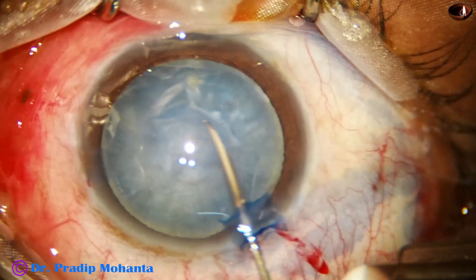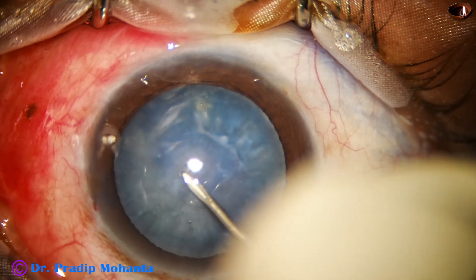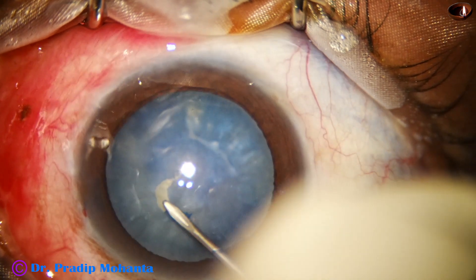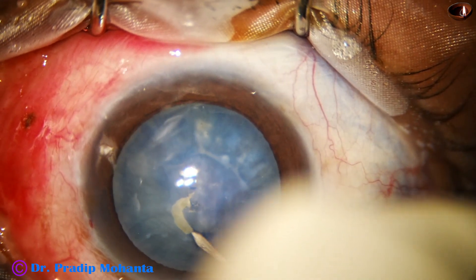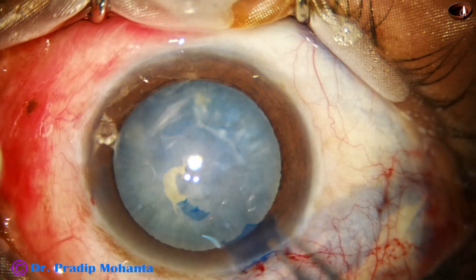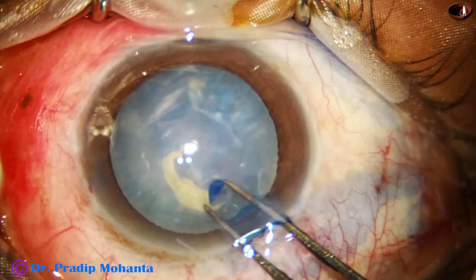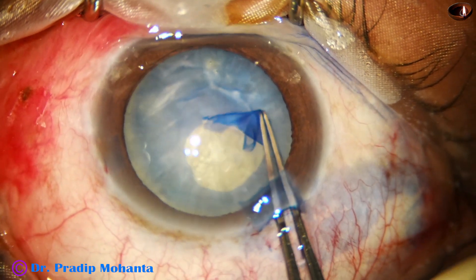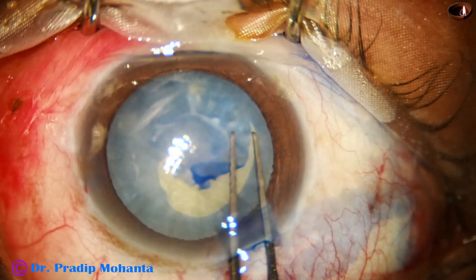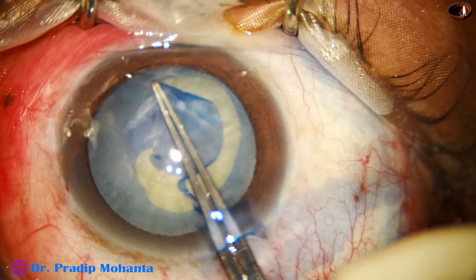Now I take a sharp 26-gauge bent needle and try to make a puncture at the center of the capsule. Because of subcapsular fibrosis, it becomes difficult. The capsular fibrosis is in the central part as well as it extends in the inferior aspect near the periphery. So I have to go around this fibrosis, and at around 6 o'clock this area will go to the far periphery, and I have to make an attempt to bring it back.